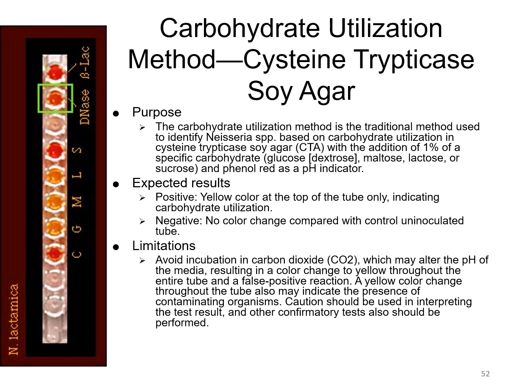I think in one of the previous lectures we talked about testing these carbohydrates in a tube test. Here you've got an example of a more modified test where each of these little wells has one of these carbohydrates in it.